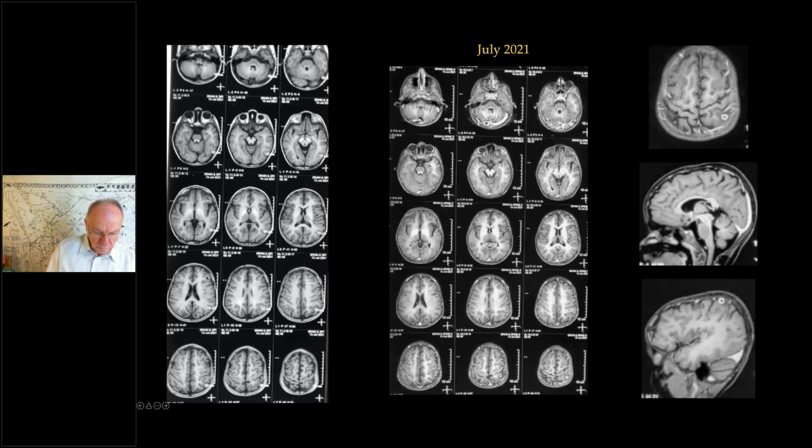And also, for a 5.5-year-old child, the white matter is slightly hyperintense compared to what we normally see at this age. On the post-contrast images, again, the hyperintense changes do not demonstrate any contrast enhancement, but you can appreciate them. And we have this focus of ring-enhancing lesion in the left superior parietal lobule. On the sagittal images, again not very optimal, you can see sparing of the pontine belly in terms of the signal changes on the T1-weighted scans.